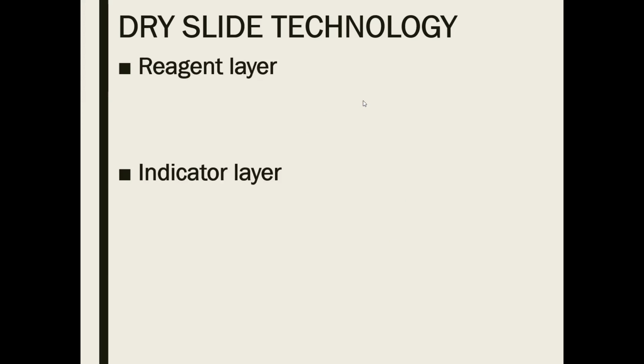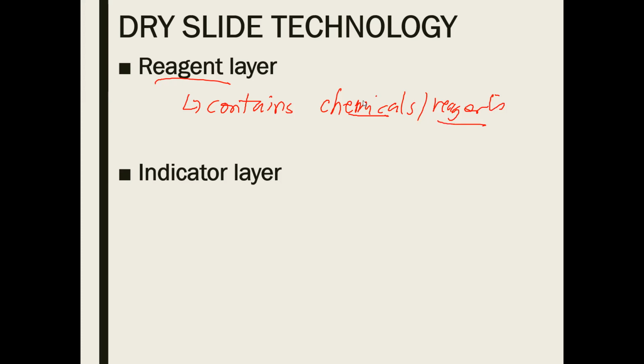Now, how about the reagent layer? Kapag po sinabi nating reagent layers, definitely it contains your chemicals. It contains your chemicals as well as your reagents. It contains your chemicals and reagents necessary for saan? Definitely necessary for reaction or necessary for testing.